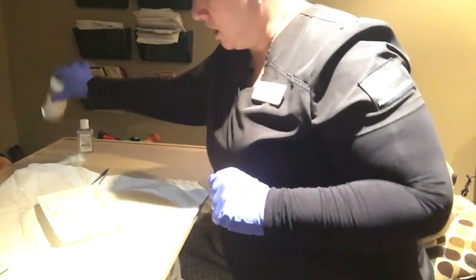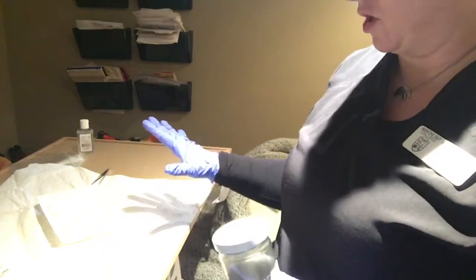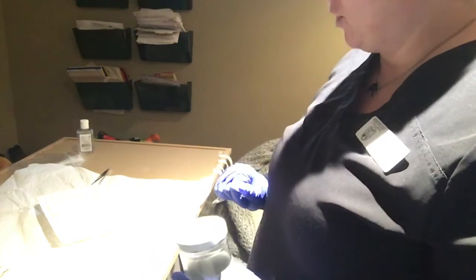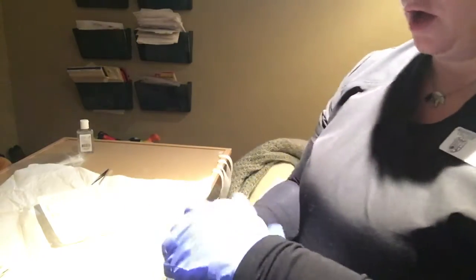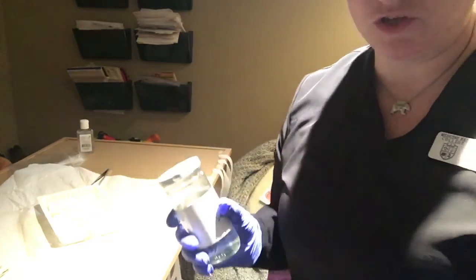Okay. Now just keep in mind that with the sterile field, we don't want to reach over it. We want to work at a waist height. We never want to turn our backs, and we don't want to cough or sneeze as well. I've got my normal saline here, which is what I'm going to use to cleanse the wound.